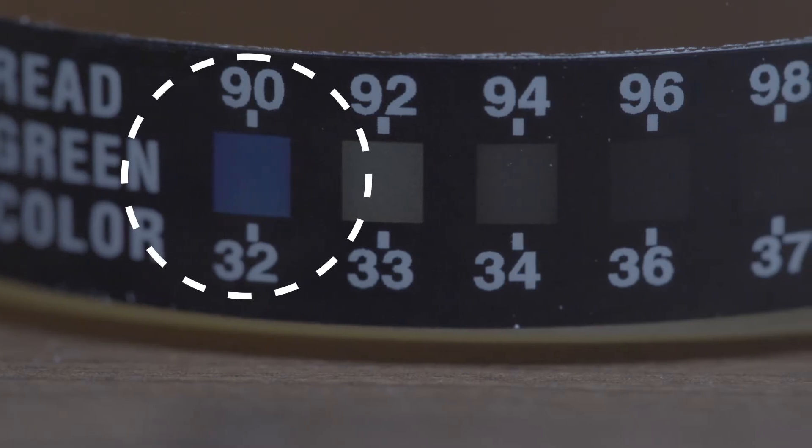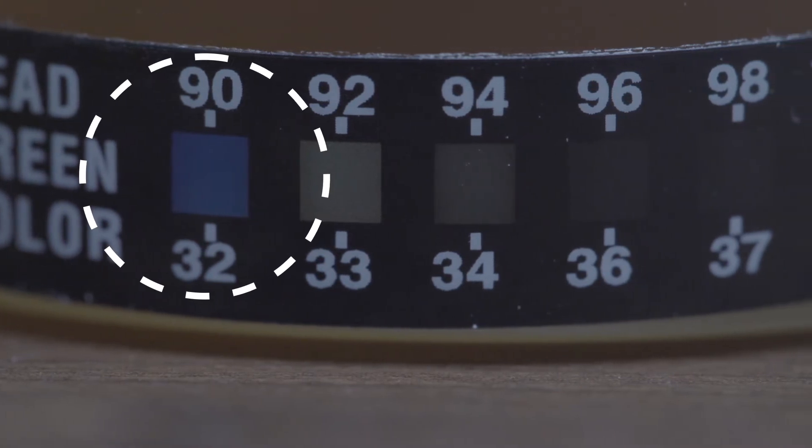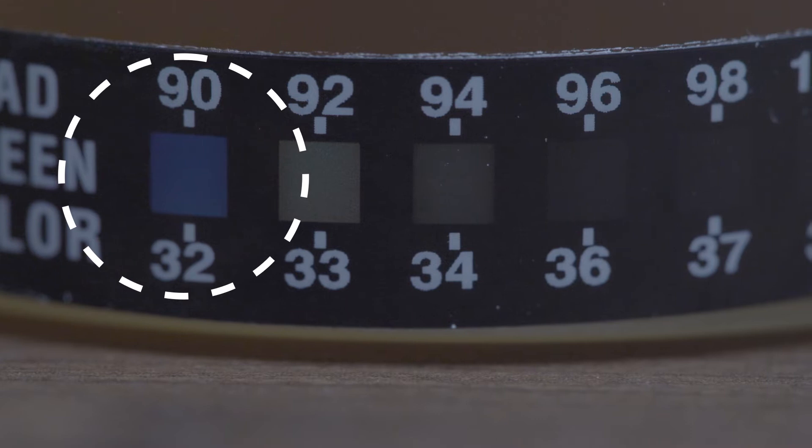At this time, check the temperature strip to make sure the specimen is within normal range. The temperature of the specimen should be within 90 to 100 degrees Fahrenheit.